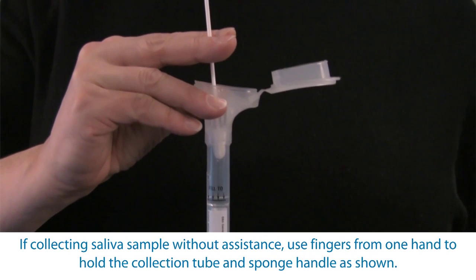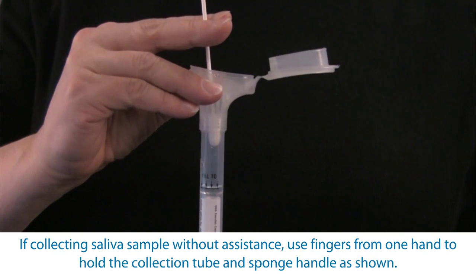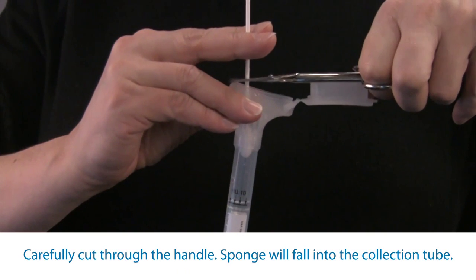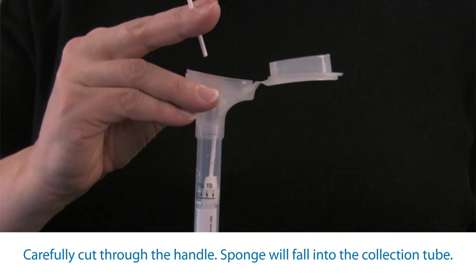If collecting saliva sample without assistance, use fingers from one hand to hold the collection tube and sponge handle as shown. Using the opposite hand, carefully cut through the handle directly above the sponge. The sponge will fall to the bottom of the collection tube.